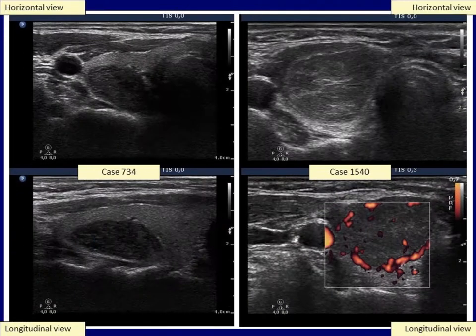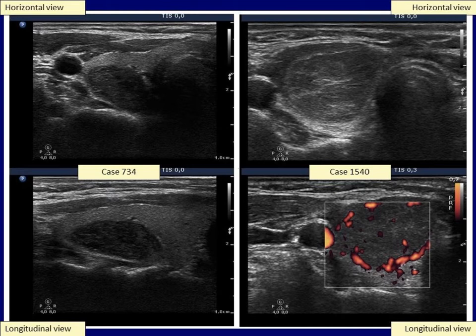Another possible issue arises in hypoechoic nodules, particularly in deeply hypoechoic lesions. This situation is demonstrated in the left nodule, which proved to be a follicular adenoma. The halo sign was also absent in the right case, which was also diagnosed as follicular adenoma on histopathology. This case demonstrates that the perinodal vascularity can be of help in detection of the capsule when halo is absent, but this will be discussed later.